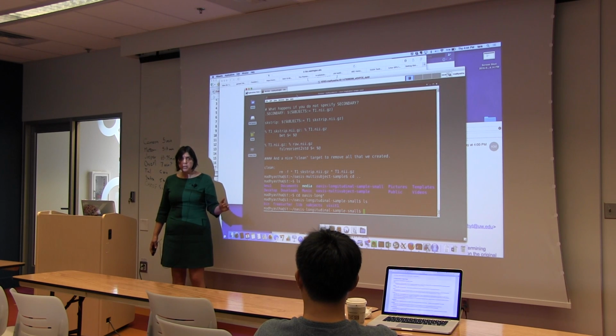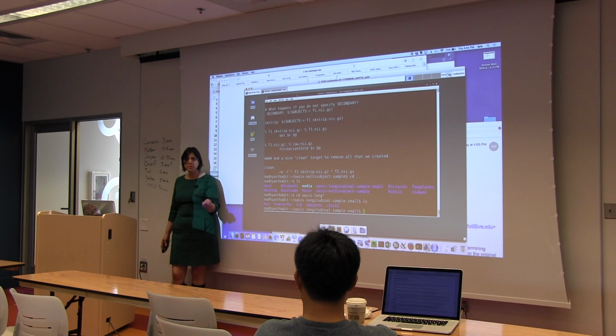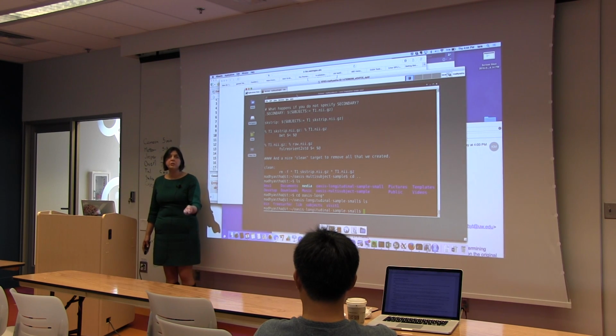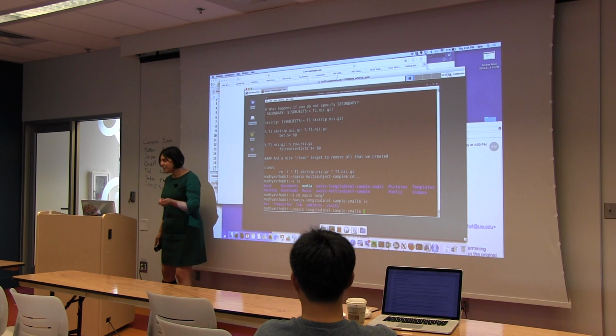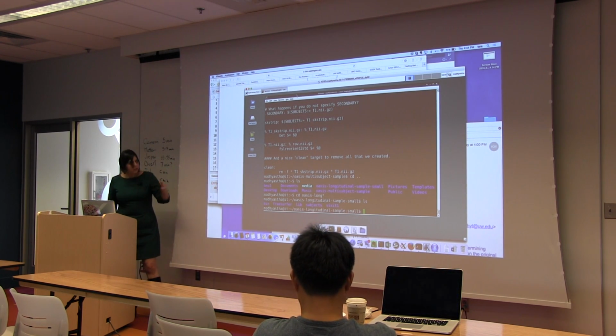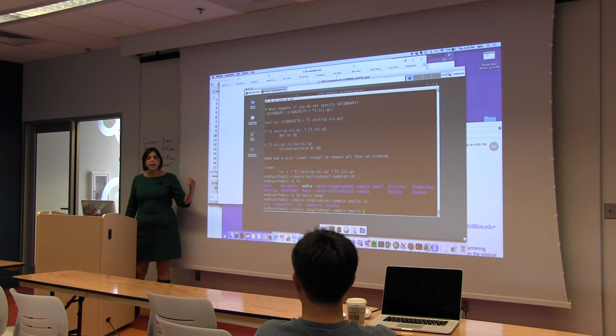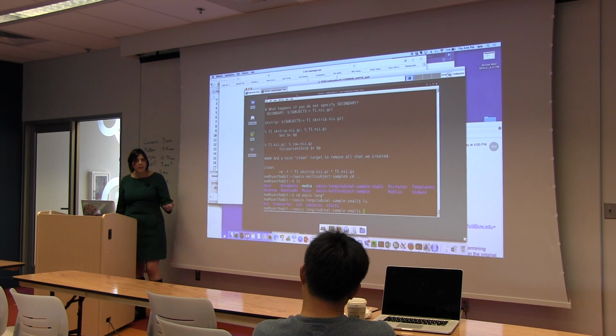You don't mess with its organization. This is another thing I've learned the hard way: you do not try to wrestle a neuroimaging program into doing something different unless you want to maintain it for the rest of your life, and I don't. So we just work with them. There's also a lib directory, for masks, makefiles, and reference things, like particular atlases that may be relevant for a project. We're just taking the Unix conventions and trying to organize our things in findable ways.